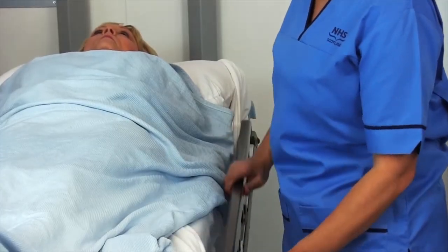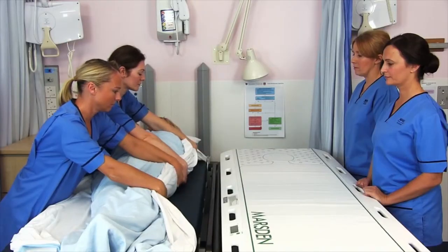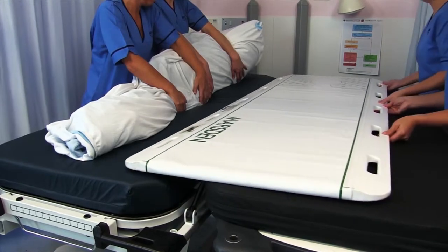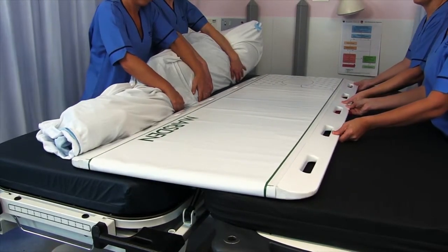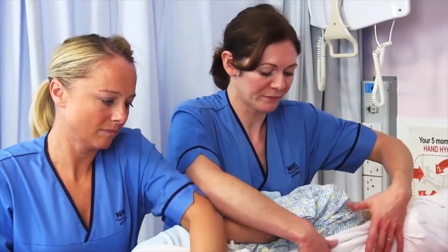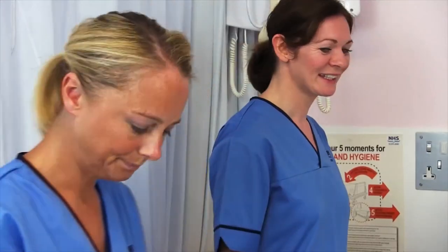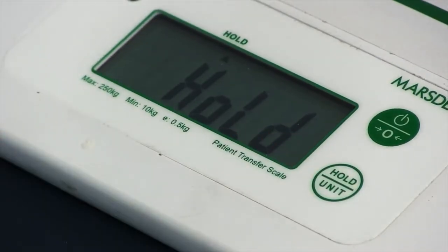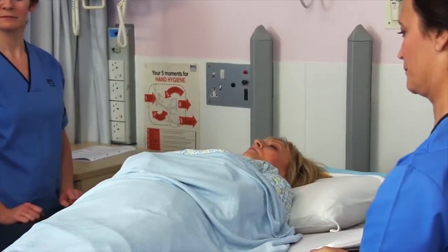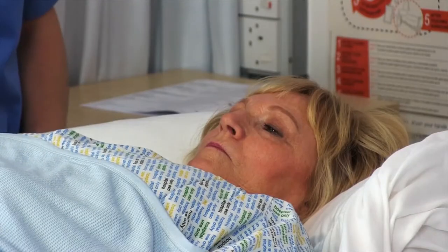When you're ready to transfer your patient, apply the brakes on the casters and roll the patient onto their side. Position the scale across the bed or trolley, ensuring both are at an equal height. There must be a minimum of 20cm of the scale on each side of the bed or trolley. Roll the patient back and onto the scale. Stop for a second and press hold. Allow the scale to display and hold the patient's weight. You can then slide the patient off the scale and you now have an accurate weight reading for your patient.